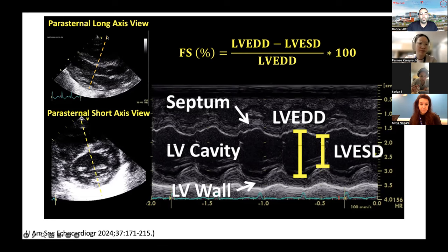And I just want to show you what I mean about angle dependency. Can you see in the guidelines how they've put their lines? Actually, if you were doing it during the scan, you wouldn't be able to do it here, because your line would start from here. So your line would actually go like this. So then it would not be angled correctly.